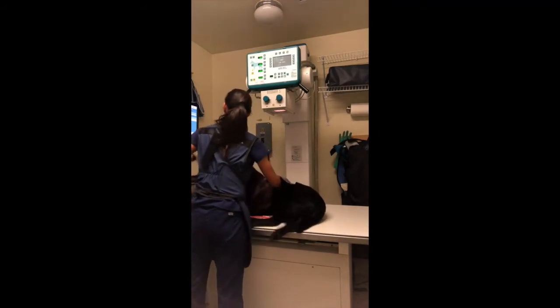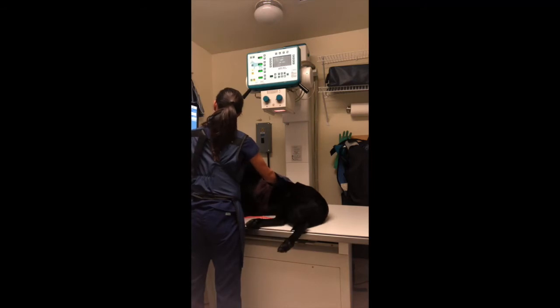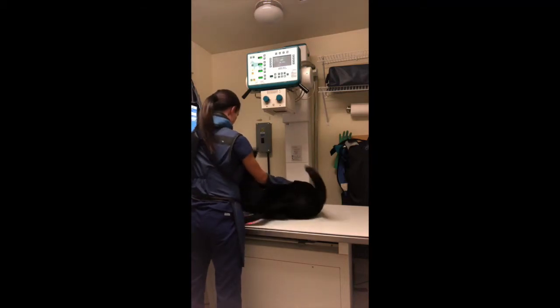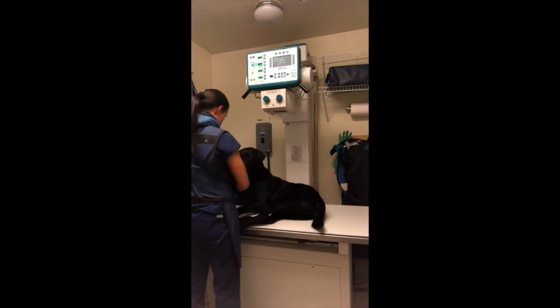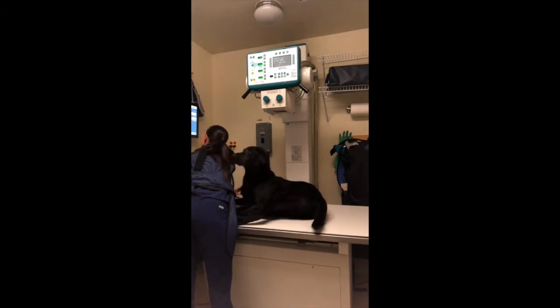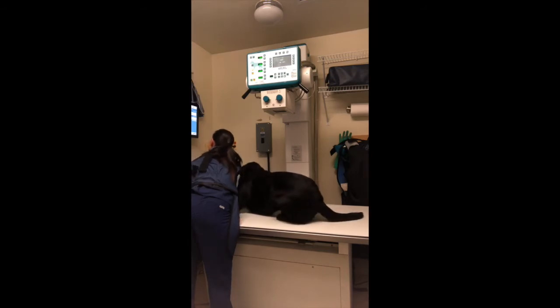The gastric emptying time of normal animals varies greatly. Factors such as the effect of medication and the type or volume of meal given also alter the times. Low dosages of barium may delay emptying and transit time because the stomach empties slower when there is less volume in the stomach. Delay may also occur in nervous animals that are stressed in the environment.